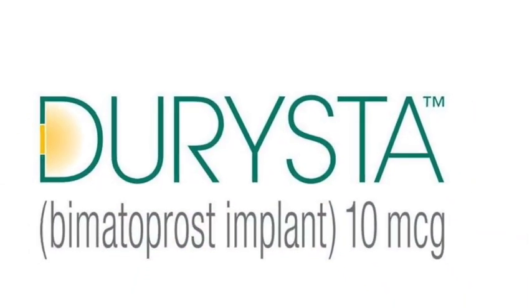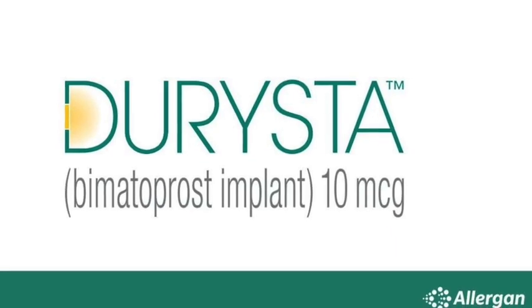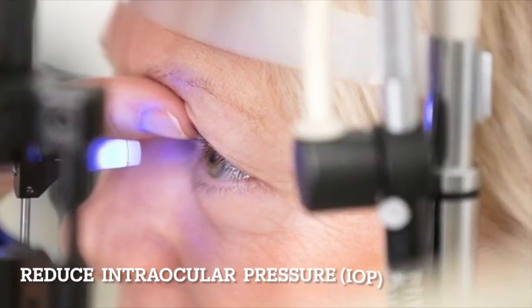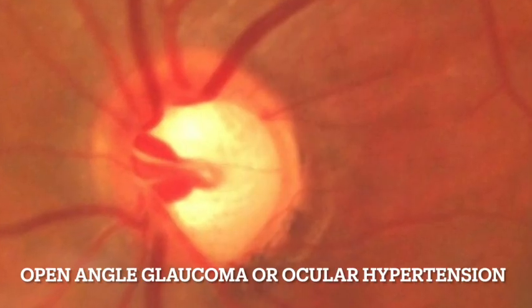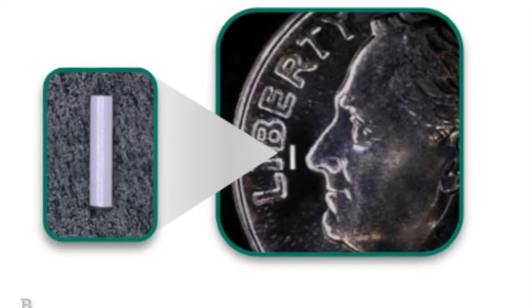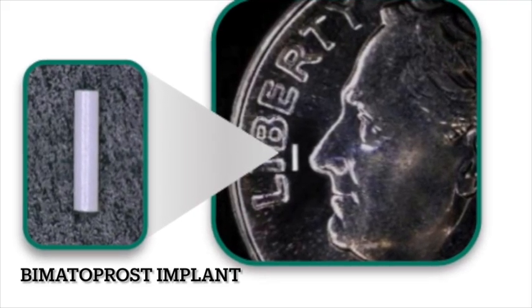Launched in 2020 by Allergan, Durista is the first and only FDA-approved intracameral sustained-release implant indicated to reduce intraocular pressure in patients with open-angle glaucoma or ocular hypertension. It consists of a dissolvable bimatoprost, which is a prostaglandin analog.